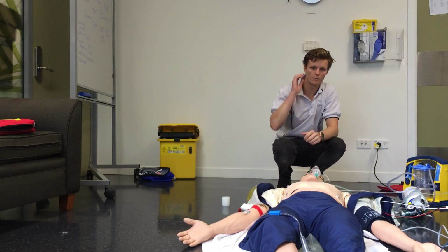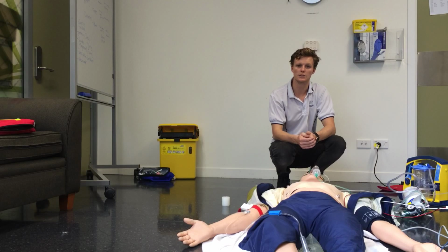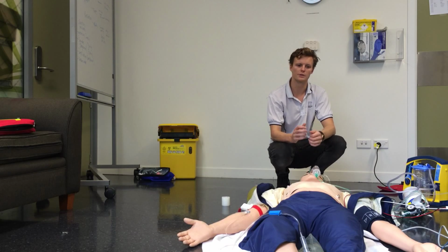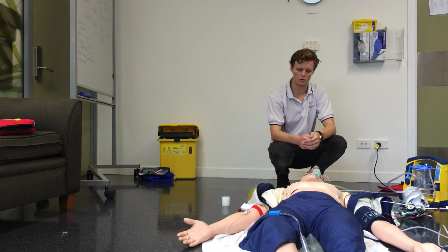Okay. So from here, if my ICP arrives, he might want me to do procedures such as BURP, which is backwards, upwards, rightwards pressure. So that helps with the intubation process and visualizing the vocal cords. He might also want me to bring the bougie out of the ET tube, and he might also need me if there's a failed intubation.